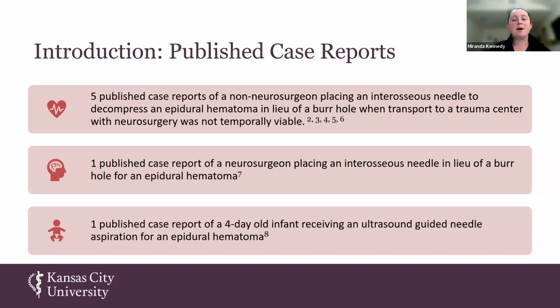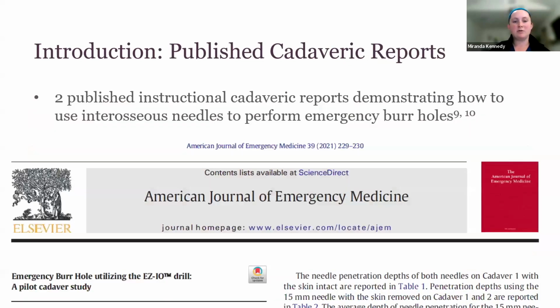There are 6 total case reports published concerning IO needle placement to decompress an epidural hematoma specifically, as well as 1 published case report of a newborn receiving ultrasound-guided needle decompression for an epidural hematoma. And there's also 2 published cadaveric reports concerning IO placement to evacuate an epidural hematoma.